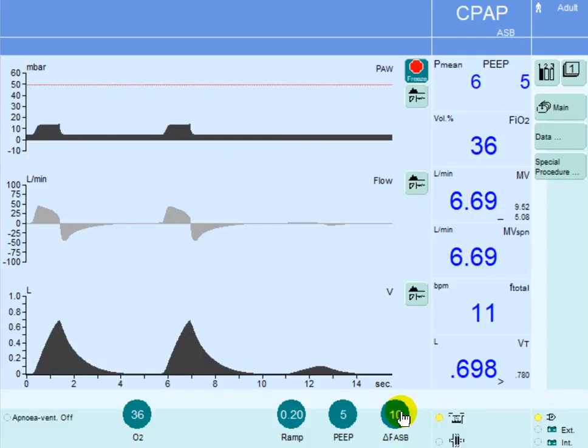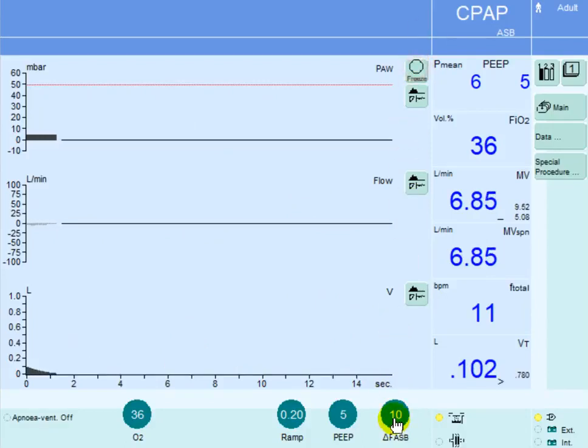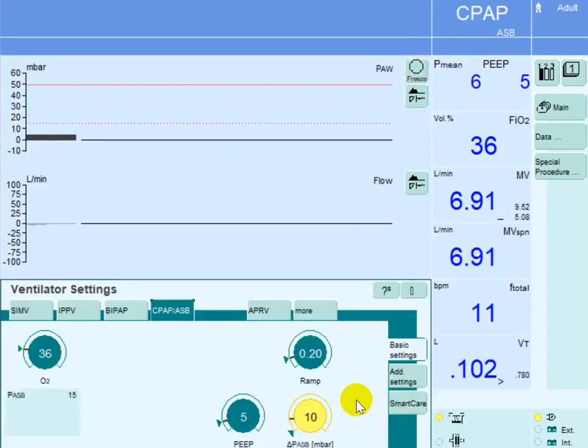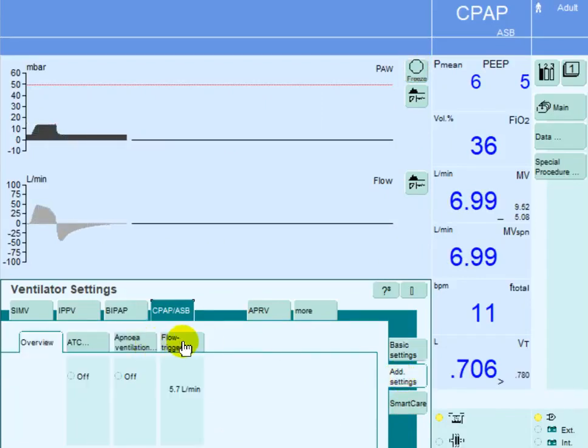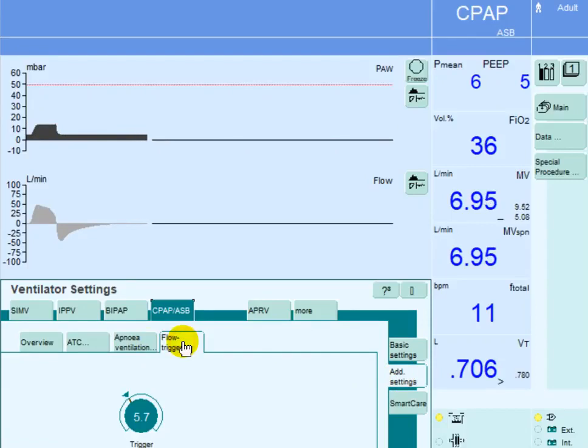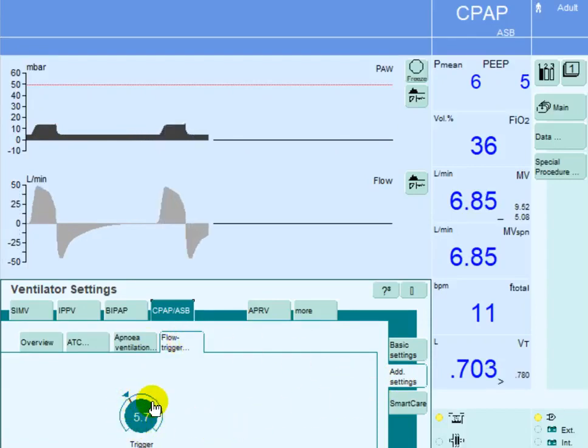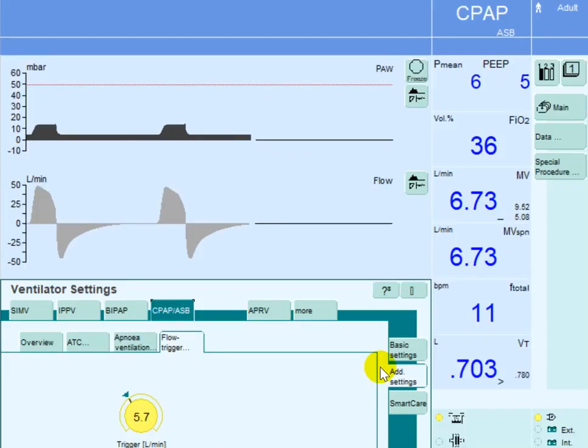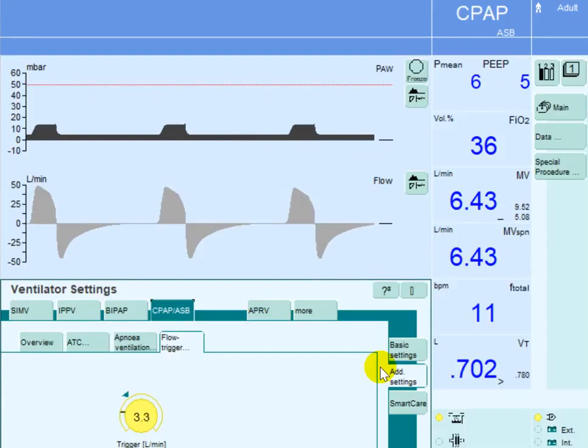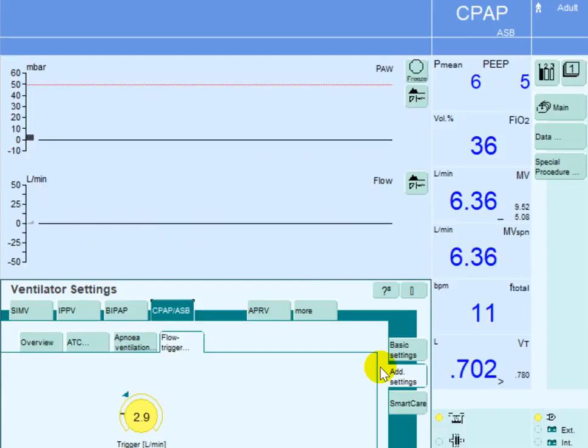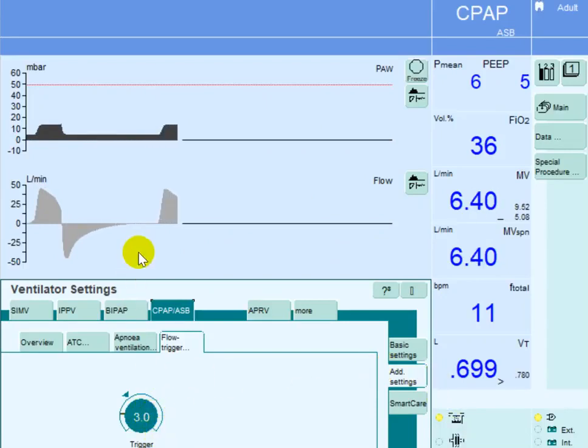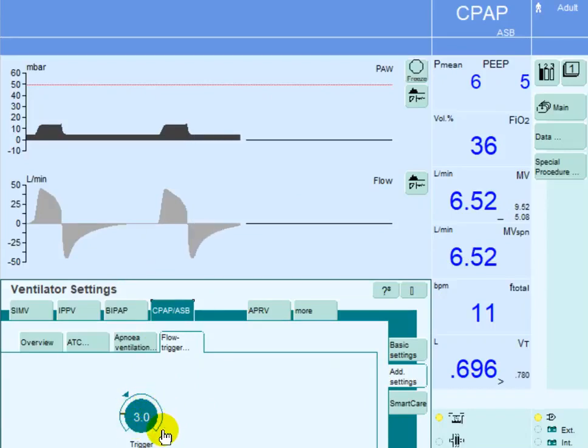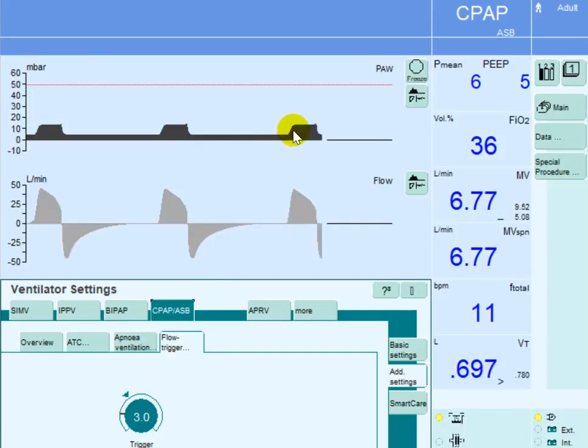In order to eliminate any wasted effort, you need to increase the sensitivity or decrease the trigger threshold. It was set at 5.7 so we need to go down on the threshold, let's say down to 3 liters per minute. This way we are increasing the sensitivity of the triggering mechanism. Now the patient has to generate only 3 liters per minute of inspiratory flow to trigger the ventilator.